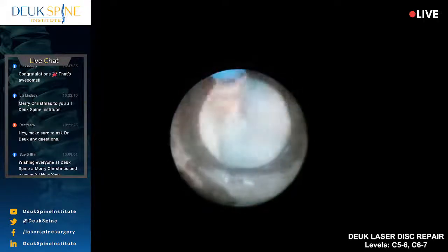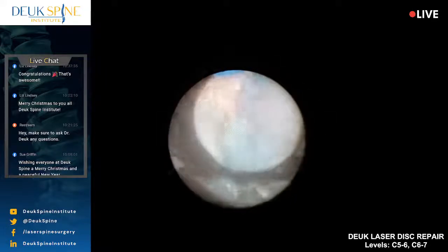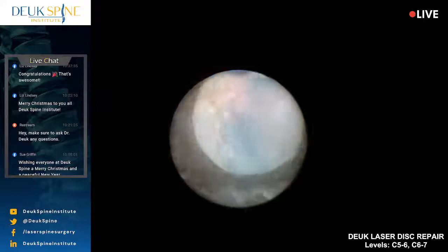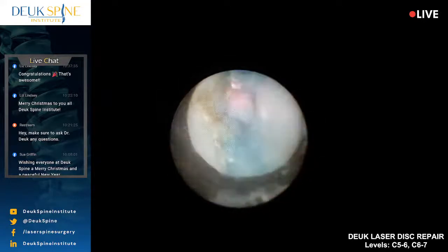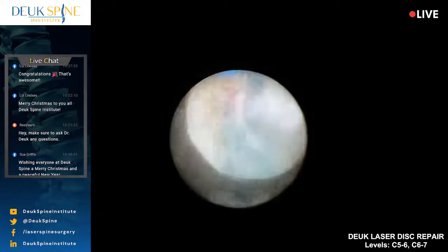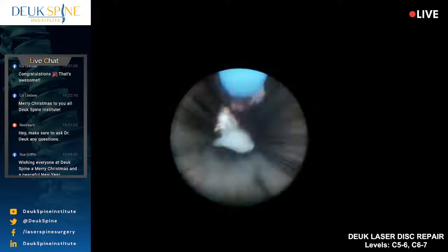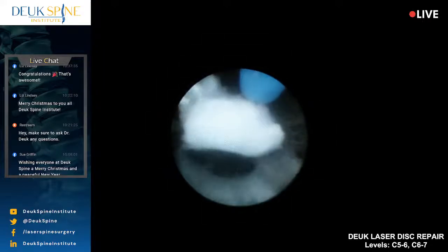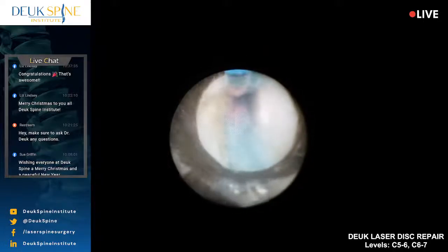Okay, we are at C5-6, and again, this disc to me is more scarred up. You can still see the end plate at 9 o'clock and 3 o'clock. That's the C5 and C6 end plate. Here's a piece of herniation right there. I'm blasting it. Look at that thing. There it goes. It just came out of the space right where the spinal cord and nerve are. We call that the epidural space.